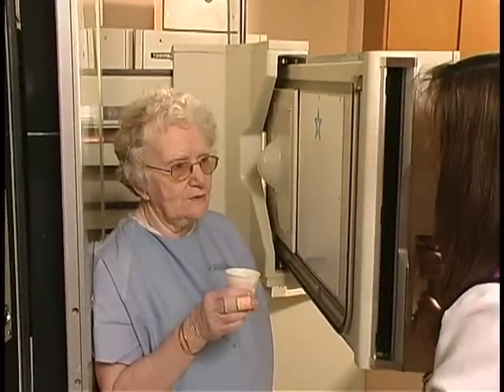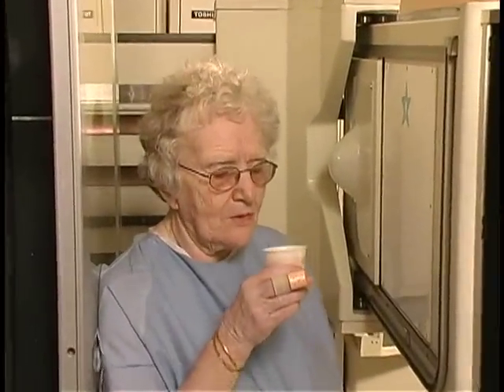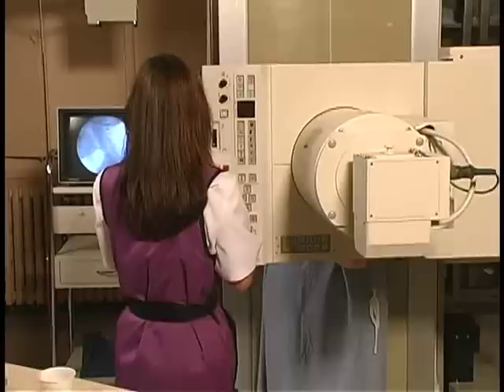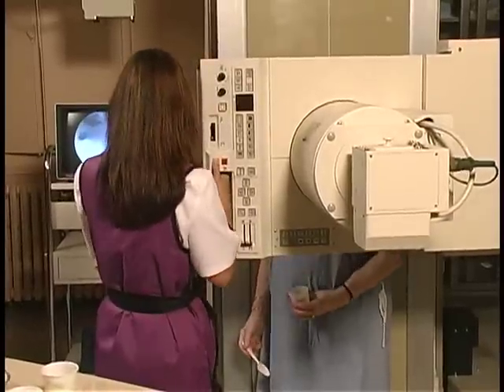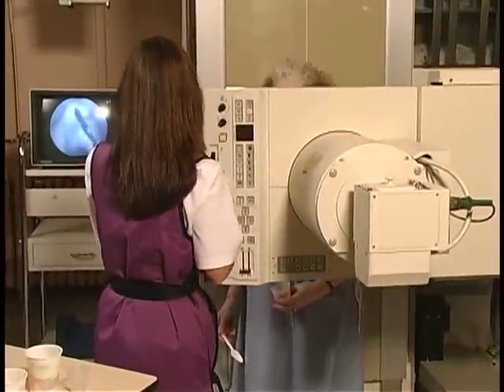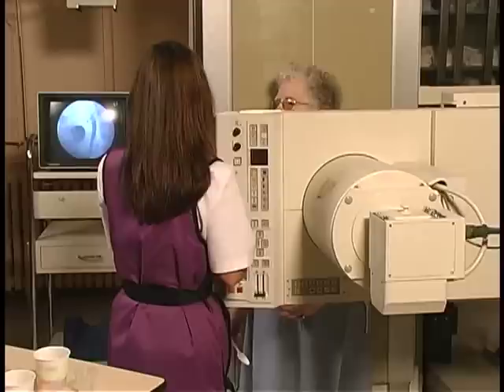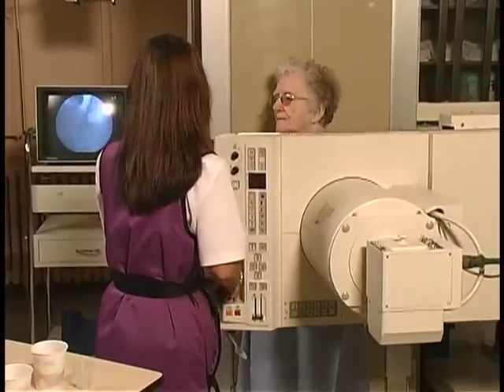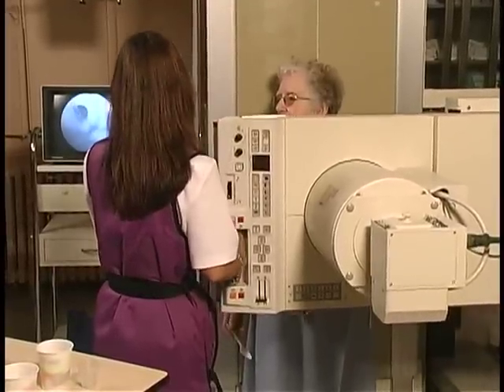Contrary to the barium swallow study, which sees the client ingest a large quantity of liquid barium, the practitioner here uses a lesser quantity of barium sulfate so as not to obscure the structures under observation and to minimize the risks in the event of aspiration.